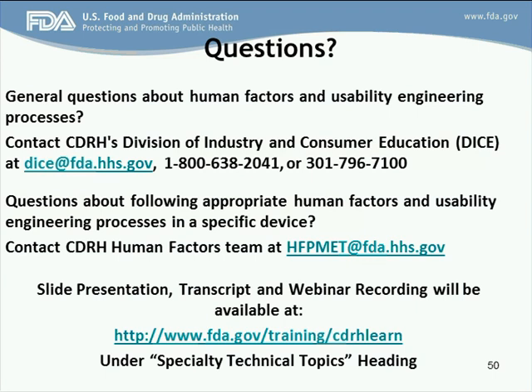Hi, Nathan. This is Shannon. In response to that, there are various types of data that can be generated in these tests, and some of that can be objective data that's viewed through performance. As we're looking at expected use, you can capture information on critical tasks along those lines, and other information can be captured through knowledge tests, which is about the understanding and comprehension of specific information within your user interface. So sometimes what you might be referring to as expert use might be something along those lines of knowledge tasks, confirming that the information is clear and understandable by the user.